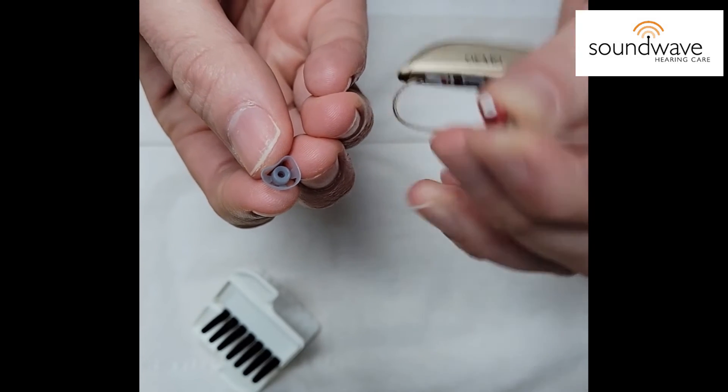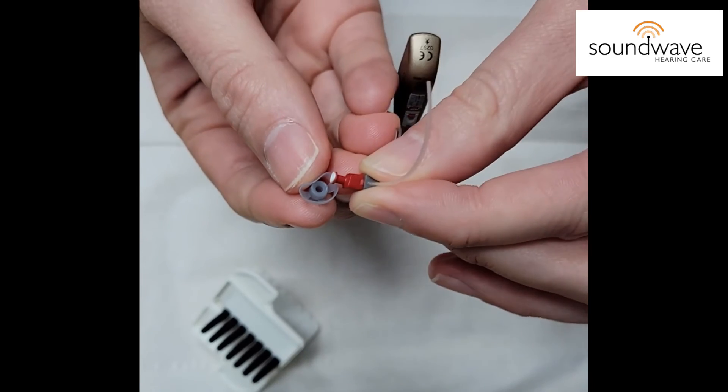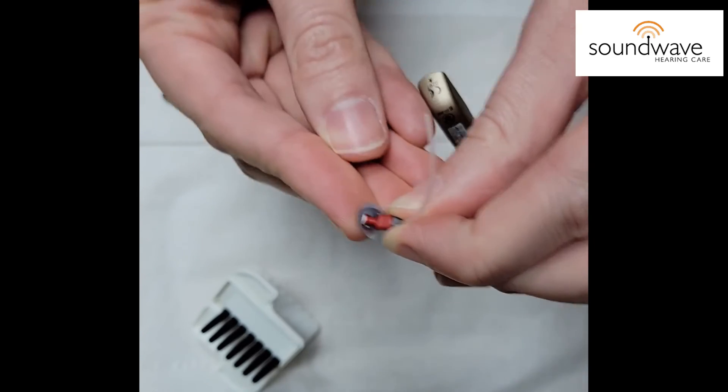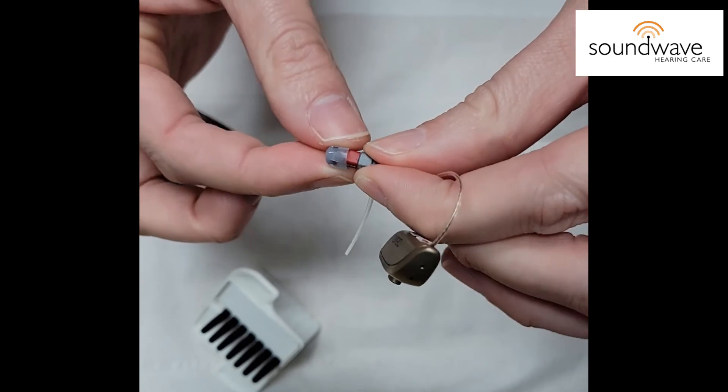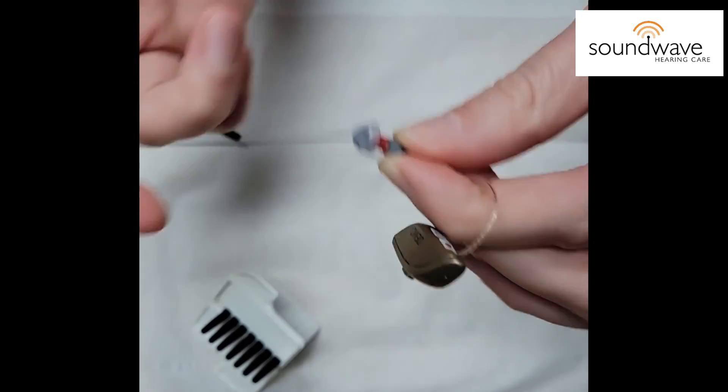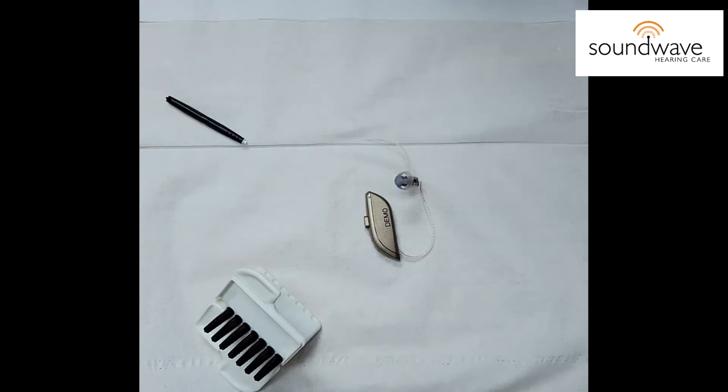As you can see there's a little circle within the larger circumference. You're going to line it up and push it on and I always recommend giving it a little tug. And now your hearing aid will hopefully work.